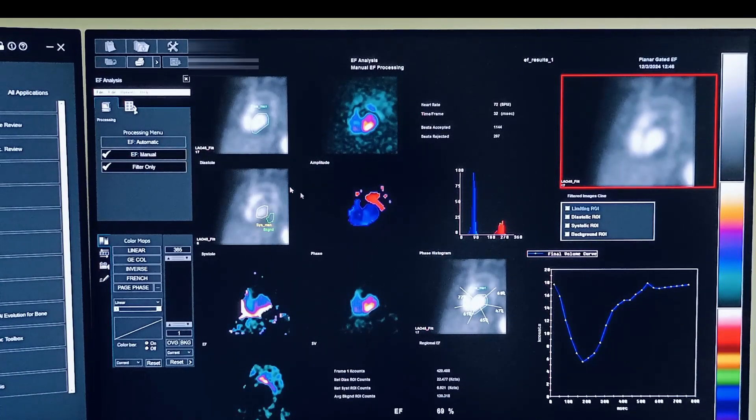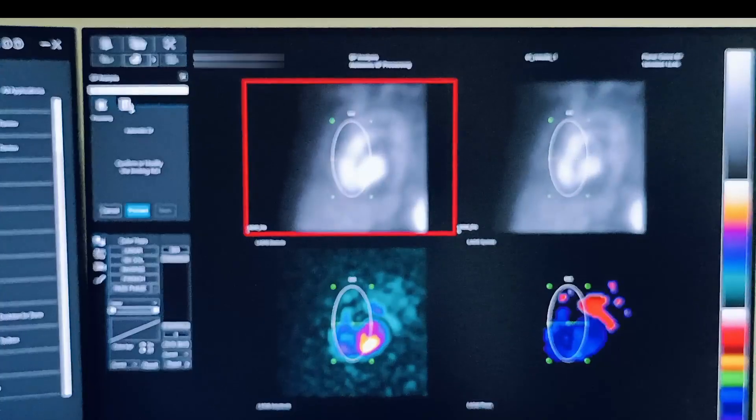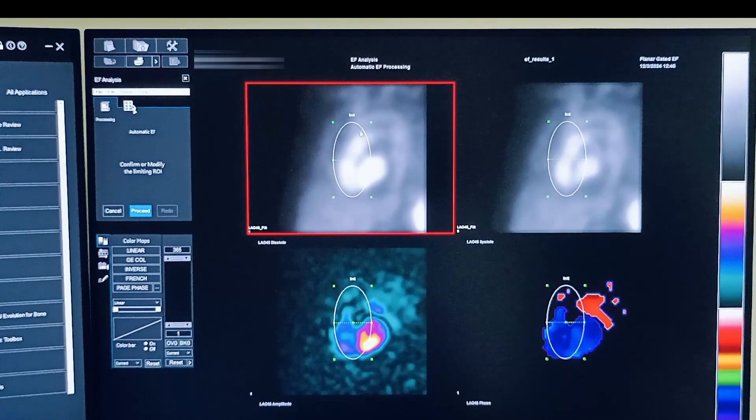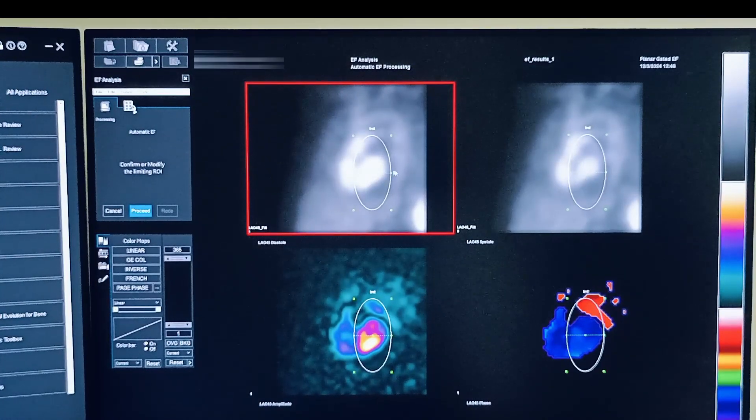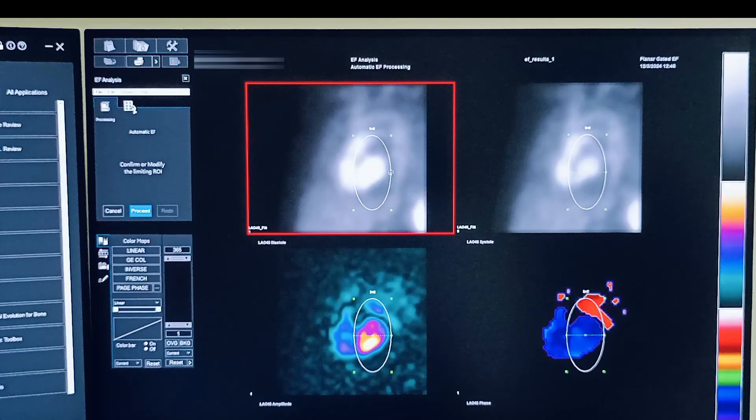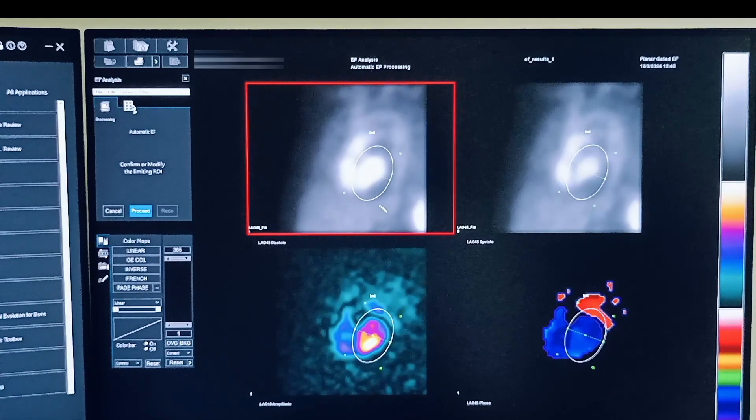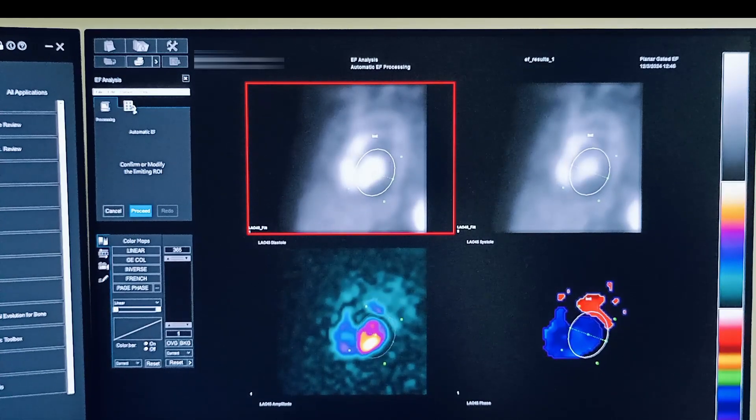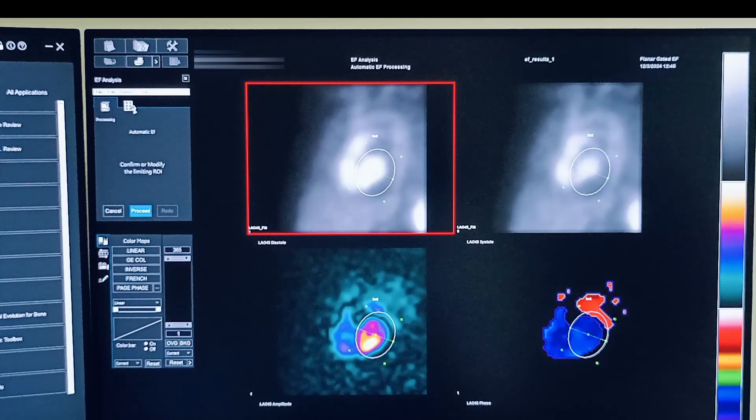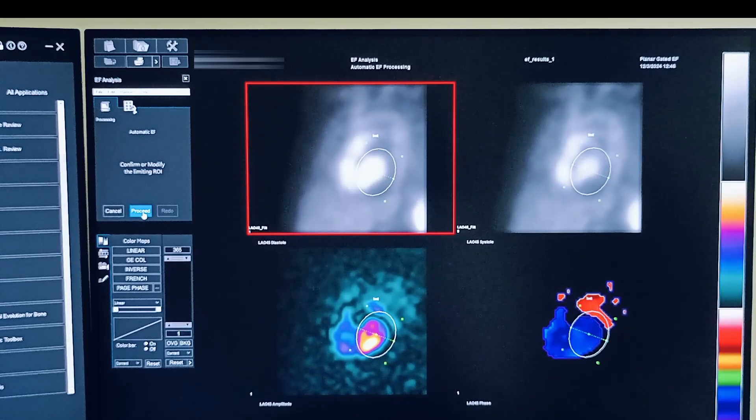The same thing you can do with automatic processing also. So here there is a bounding ROI. You have to reposition, confine it within the ROI, and just click proceed.